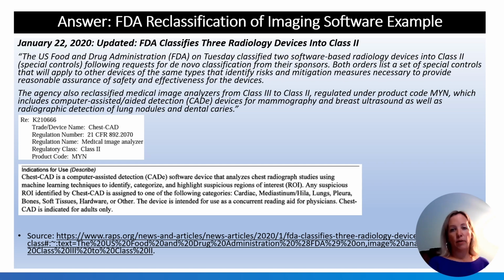It's how it interfaces with the clinical condition and what the software functionality and algorithms look like in order to treat or diagnose that clinical condition. So some food for thought here, but the clinical data that you would collect would be similar to any class 2 device. And for Europe, similar again. The clinical evaluation is not too entirely different between the US and Europe.